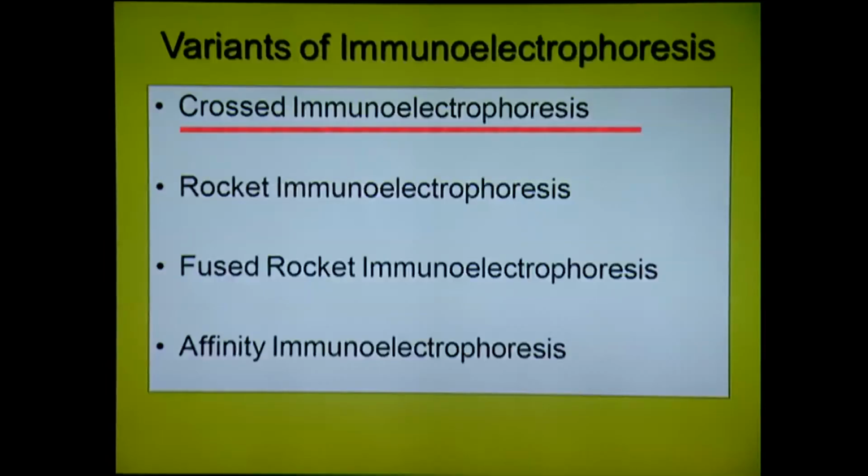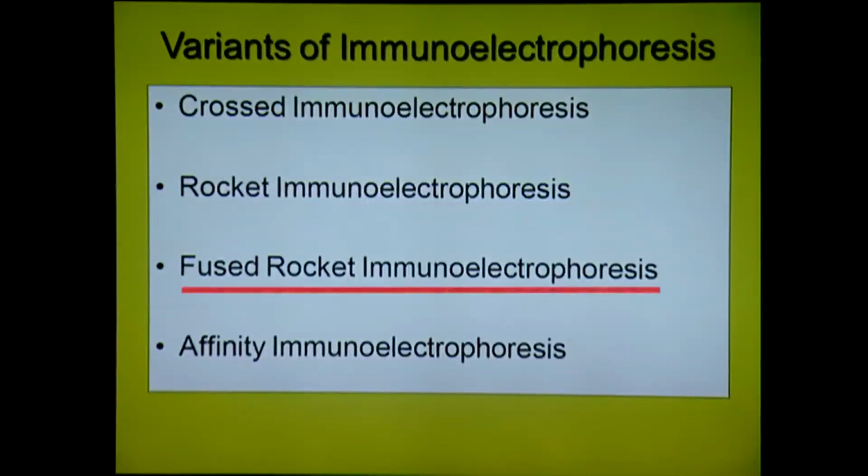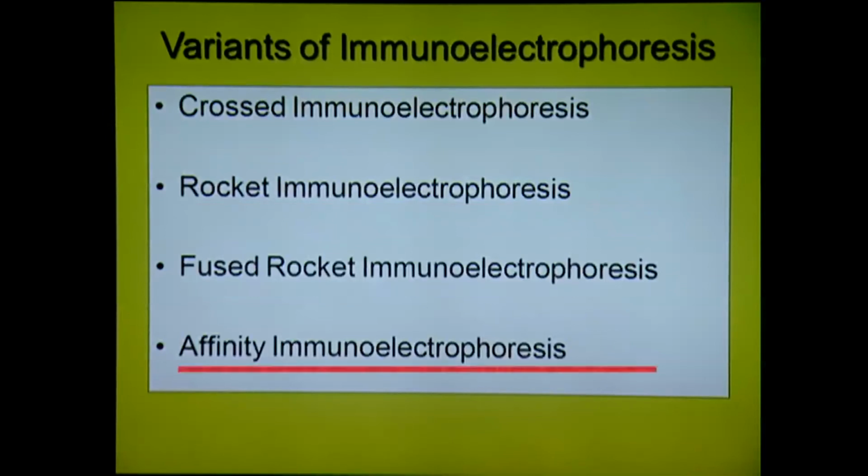Now, the immunoelectrophoresis technique has been modified further, and different variants of immunoelectrophoresis are available, like crossed immunoelectrophoresis, rocket immunoelectrophoresis, fused rocket immunoelectrophoresis, affinity immunoelectrophoresis, etc.